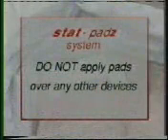The skin must be dry or the electrodes will not adhere. Use the patient's gown or a bedsheet to wipe any perspiration off the patient. No prep solutions are needed. Any ointments or gels on the patient's skin should be removed before the pads are applied. The pads should never be applied over any other device, such as wires, tubes, drains, dressings, or ECG electrodes.